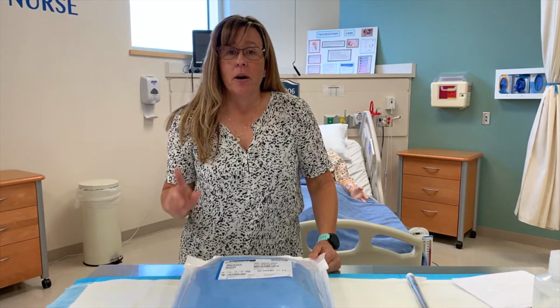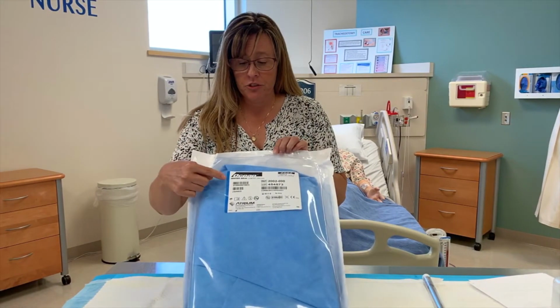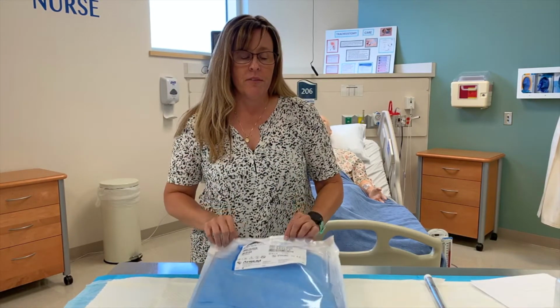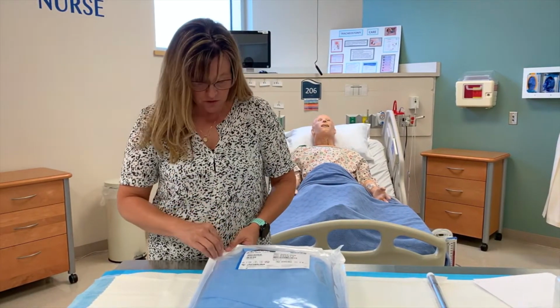Hey everybody, I'm going to help you understand and be more comfortable with chest tubes in the care of a chest tube patient. What you'll first do is get the supplies, and what you're going to need is a WaterSeal chest tube kit. This kit will have everything you need to hook the patient up to the actual chest tube itself after it's been inserted.